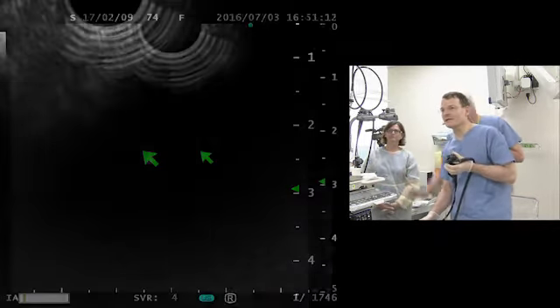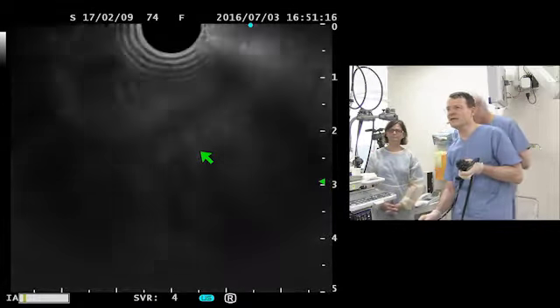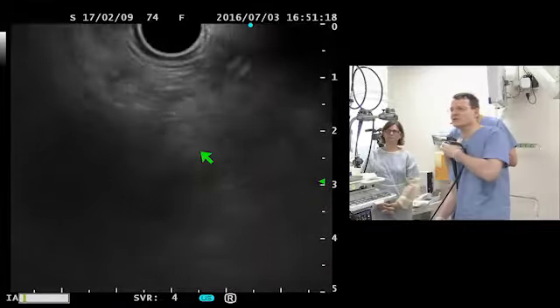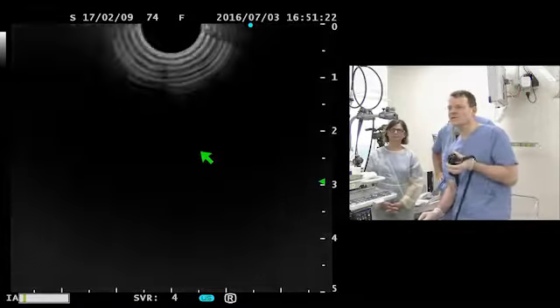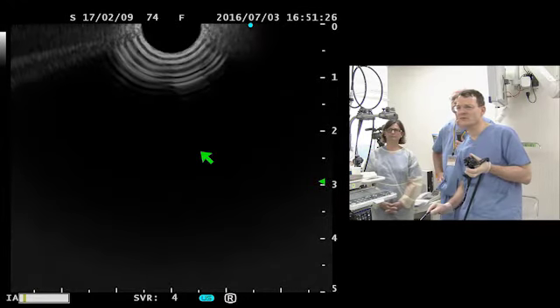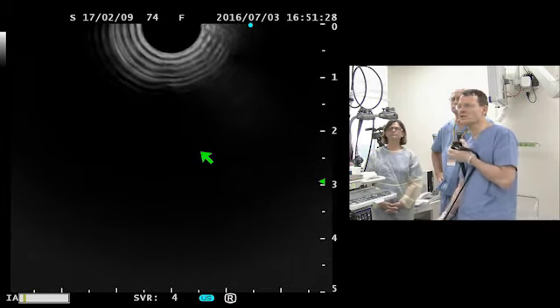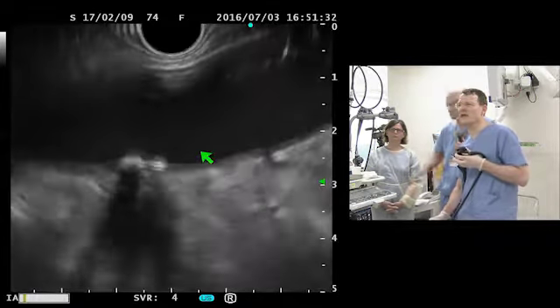As he mentioned, and as we mentioned yesterday, we can try to start in the duodenum, or we can try in the cardia. In this case, I will also try to start in the cardia. So I pull the scope back to the GE junction. Now we switch to endoscopic ultrasound, and here we have the aorta.